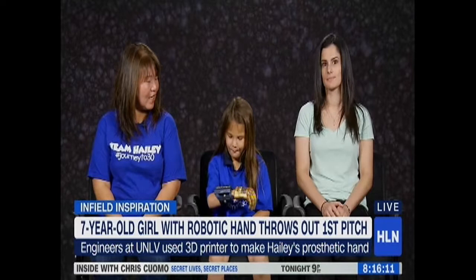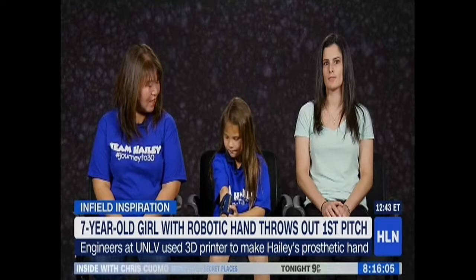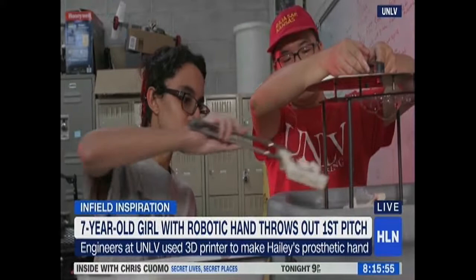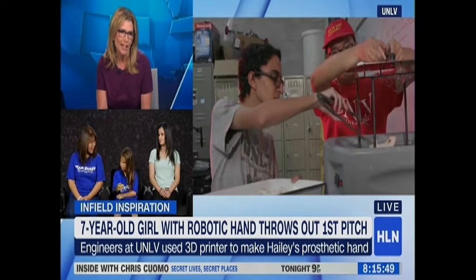How long did it take to develop? For this one, we modified an original file that was online. It was about six months to make the correct changes, and it didn't break right away once we gave it to her. That's amazing — Haley, it's sort of like your Wonder Woman hand! What does it feel like?